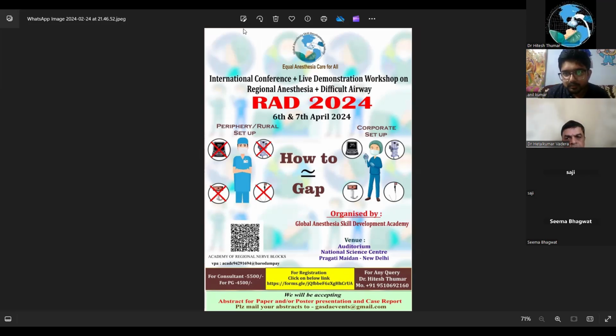Hello, yeah, you are audible. Okay, sir. So we are using it in awake patients too. After some sedation? A little bit of sedation, sir, but mostly we will use it for post-operative analgesia. The patients are tolerating it here, sir. We give just dexmedetomidine as awake sedation, and we just give the mandibular nerve block. Okay, okay, doctor.